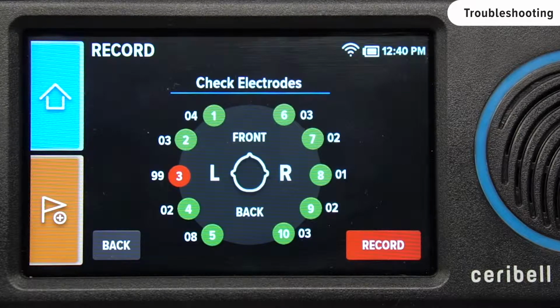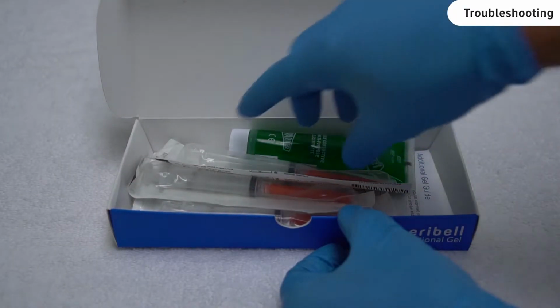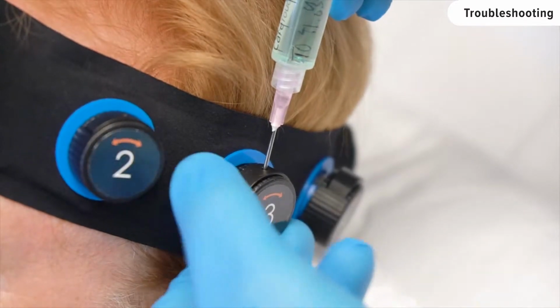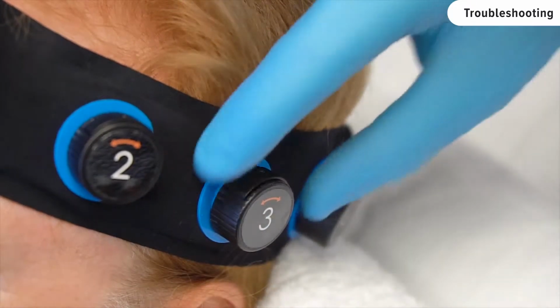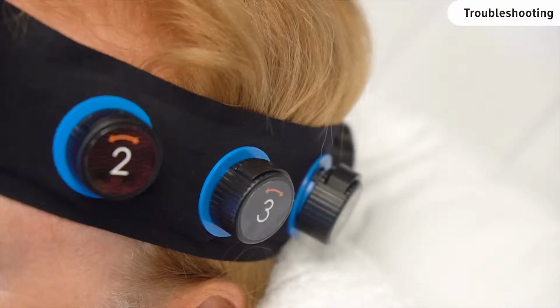If the electrode is still displayed as red after you've tried to fix it, additional electrode gel may be required. A blunt tip syringe and electrode gel are included in the Ceribell kit. Insert the syringe fully into the filling port and administer about 1 milliliter of electrode gel. Hold down the plunger or squeeze the plunger after administering additional electrode gel.